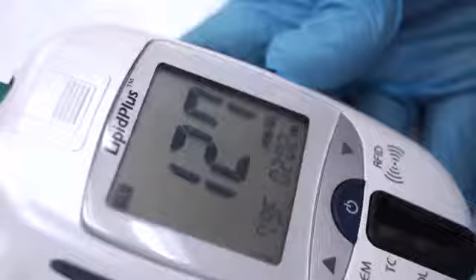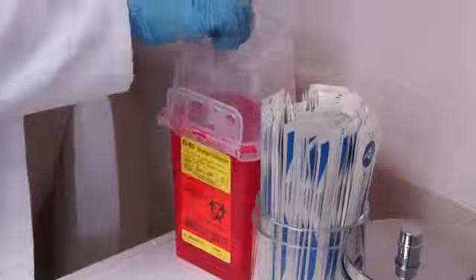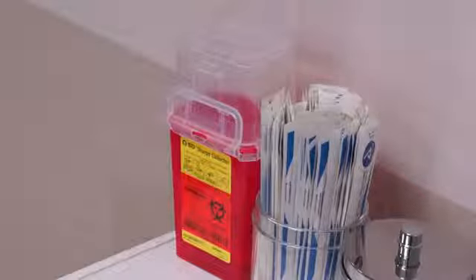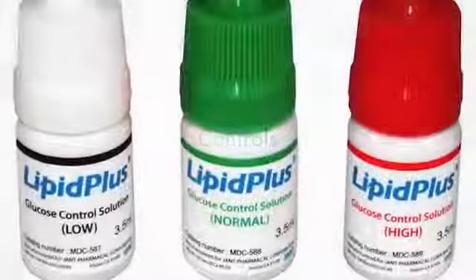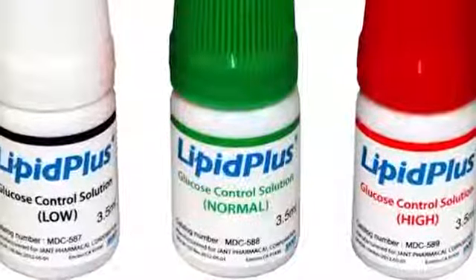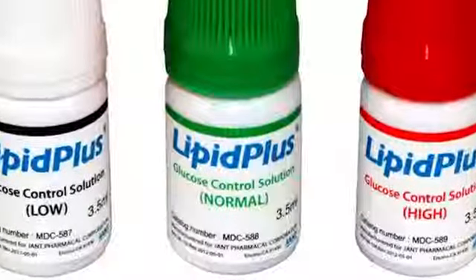After checking the test result, gently slide the ejector button forward twice to remove the test strip from the analyzer. Discard the used strip and disposable single-use lancing device appropriately in a biohazard container. Controls. Level 1, Level 2, and Level 3 control solutions are available for glucose quality control testing.